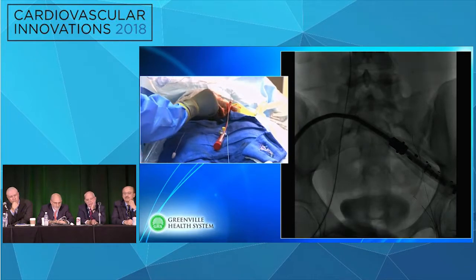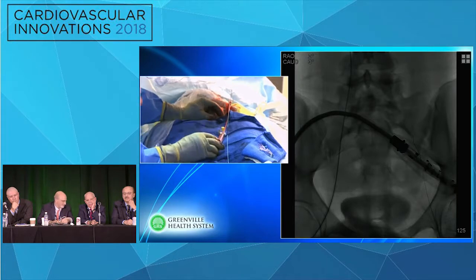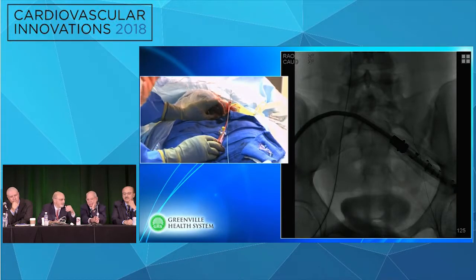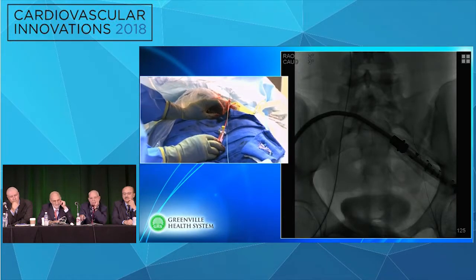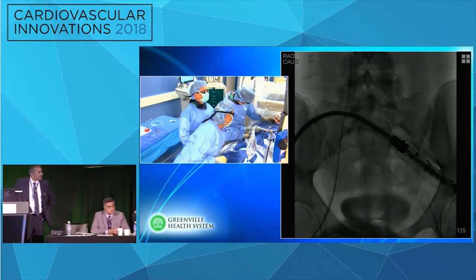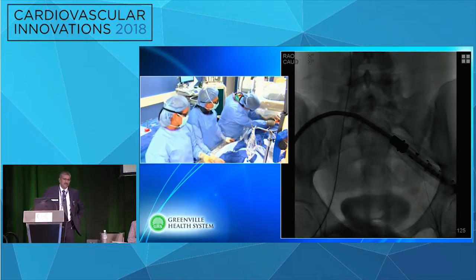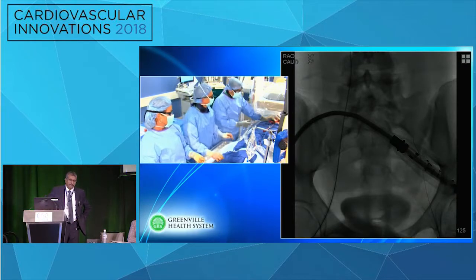In consideration of that, what I actually did was I put a SIM2 in. A SIM2, in my mind, has as much support as I can get. I mean, from an ipsilateral side, and then the strategy to come down from above, I like it. So we'll get Bruce behind this.